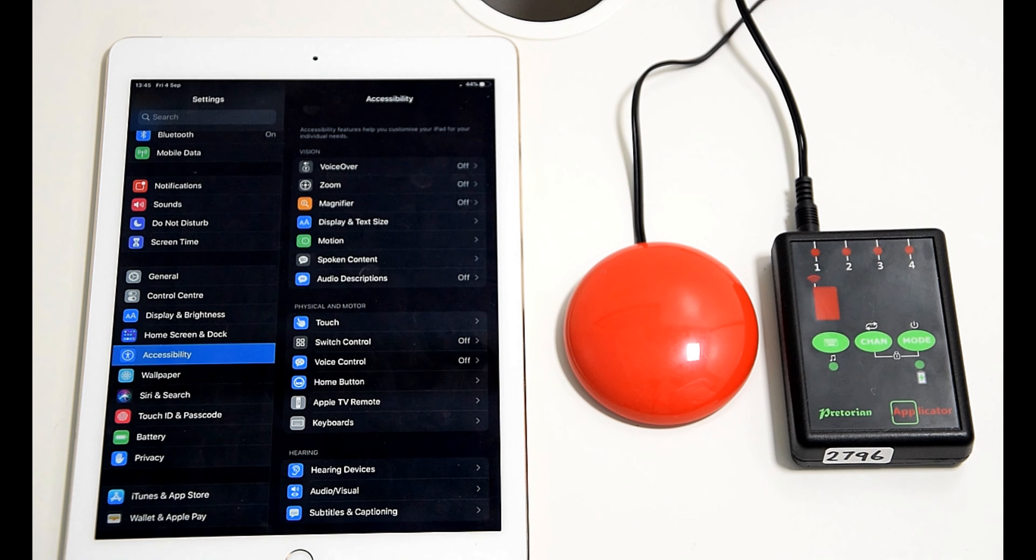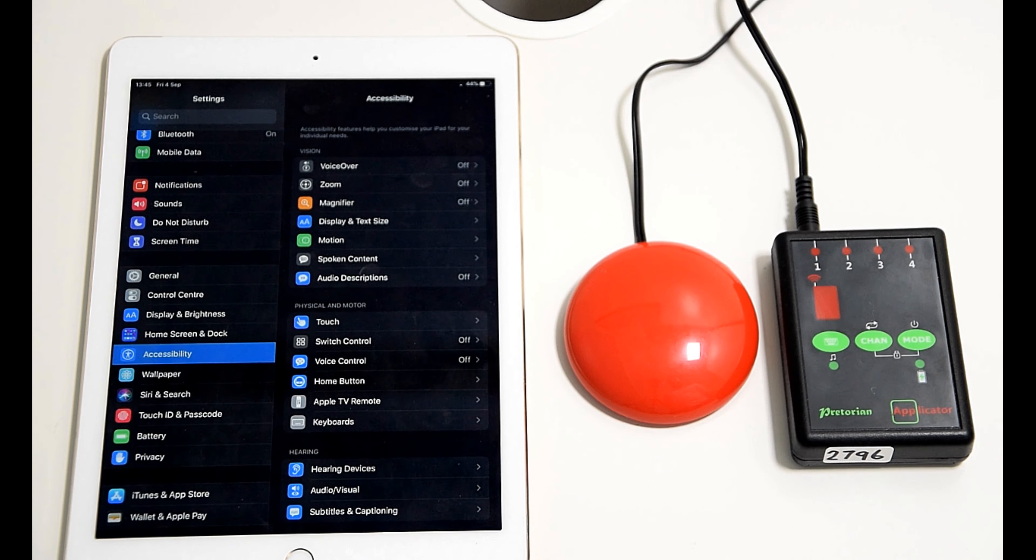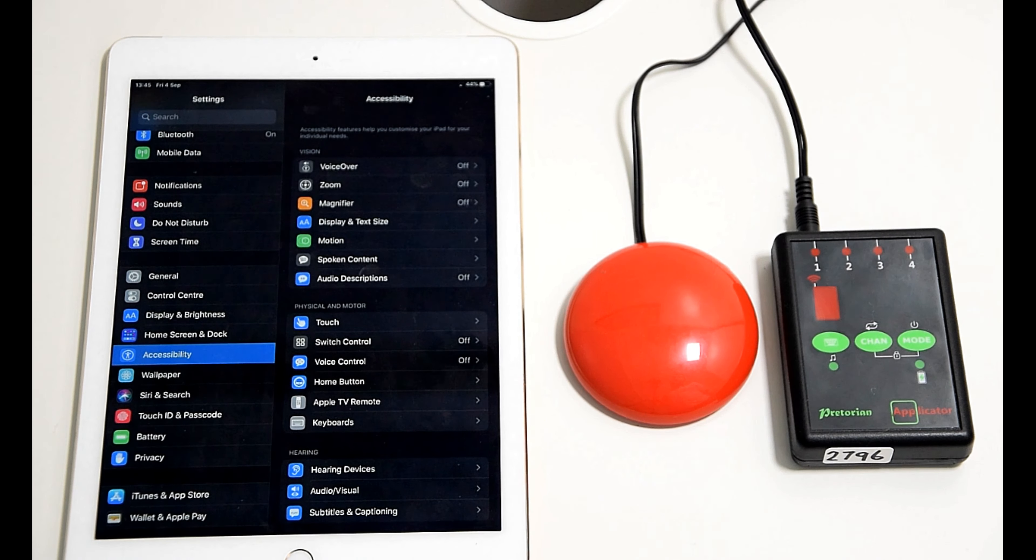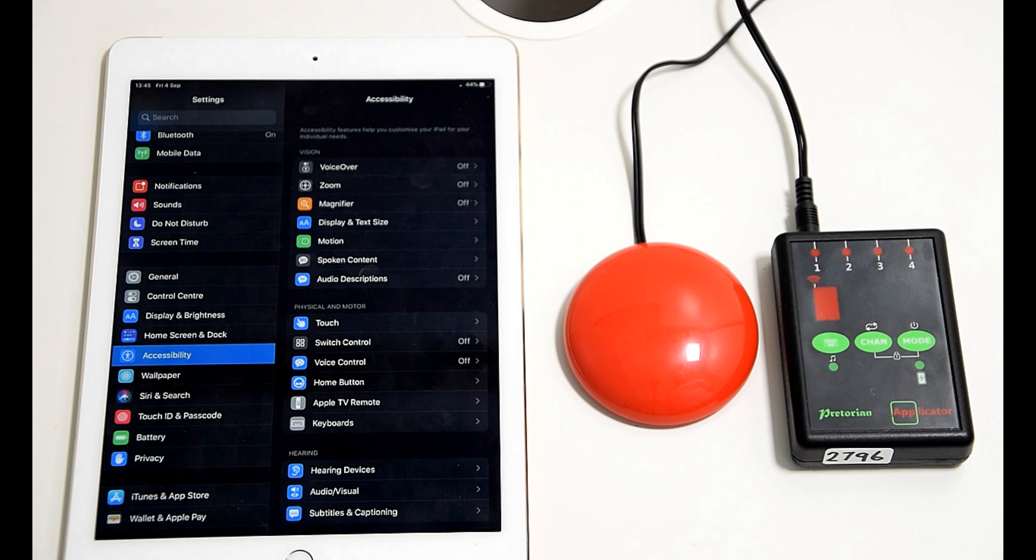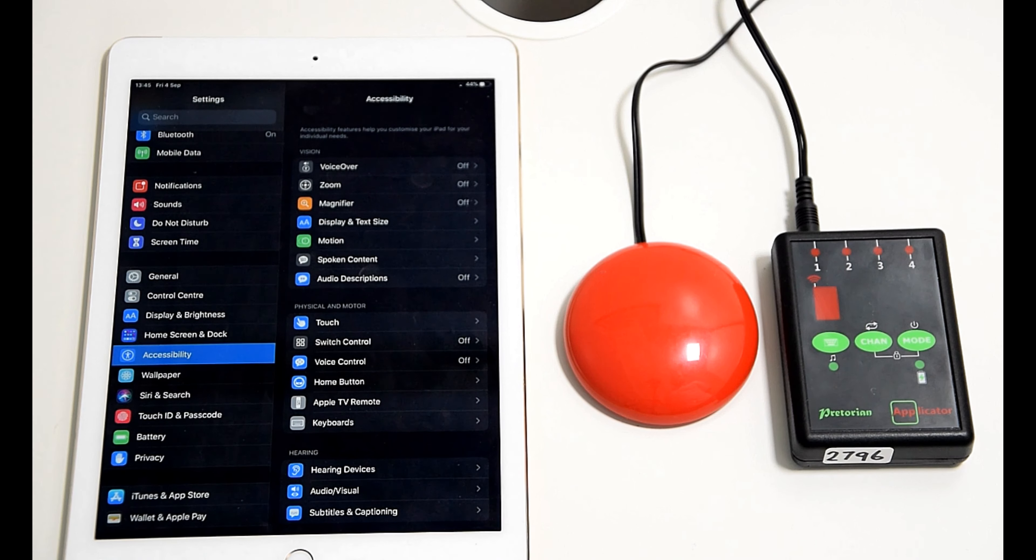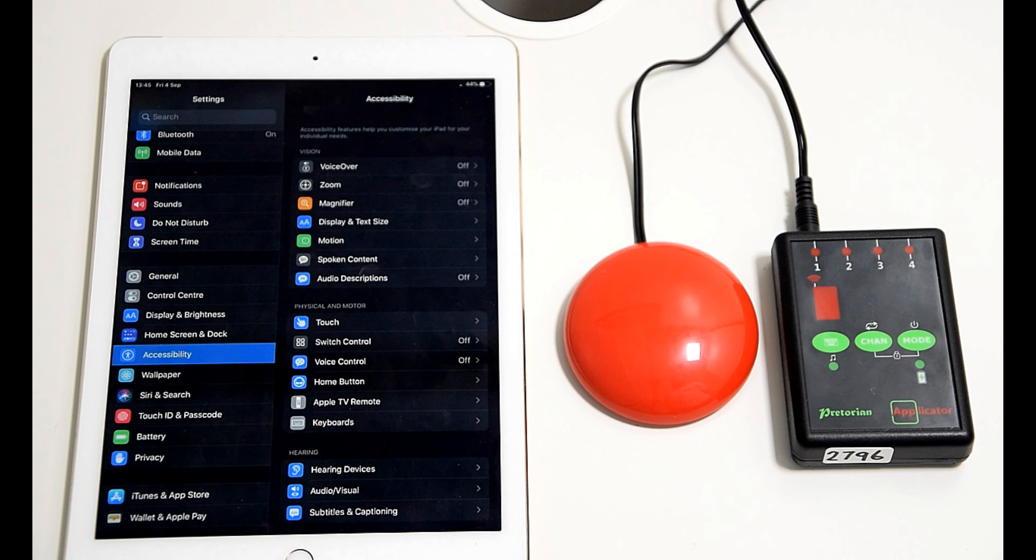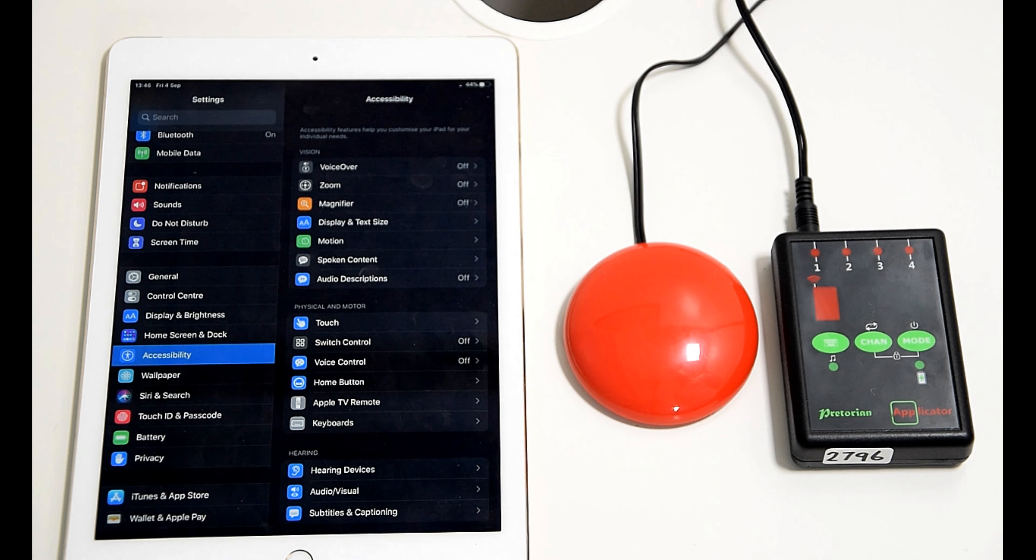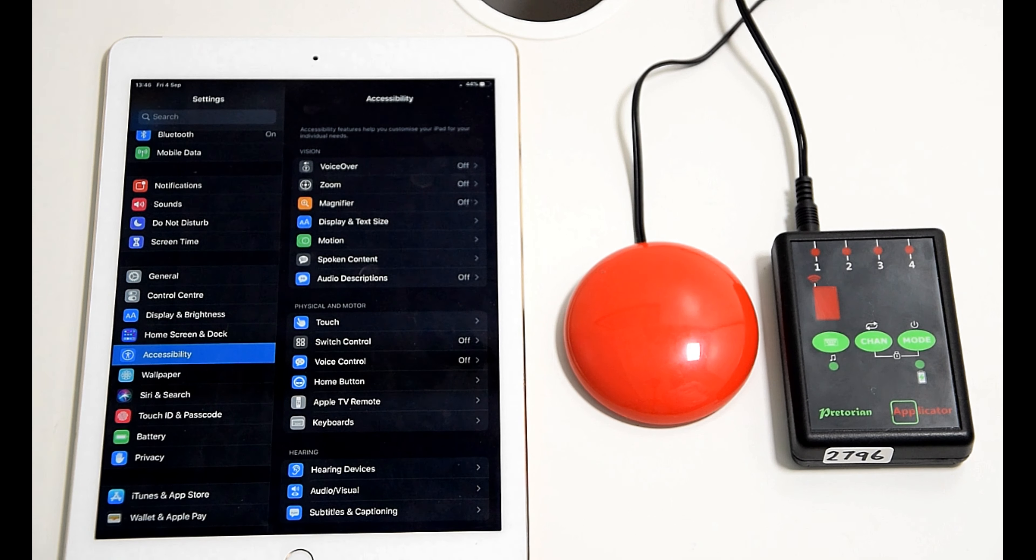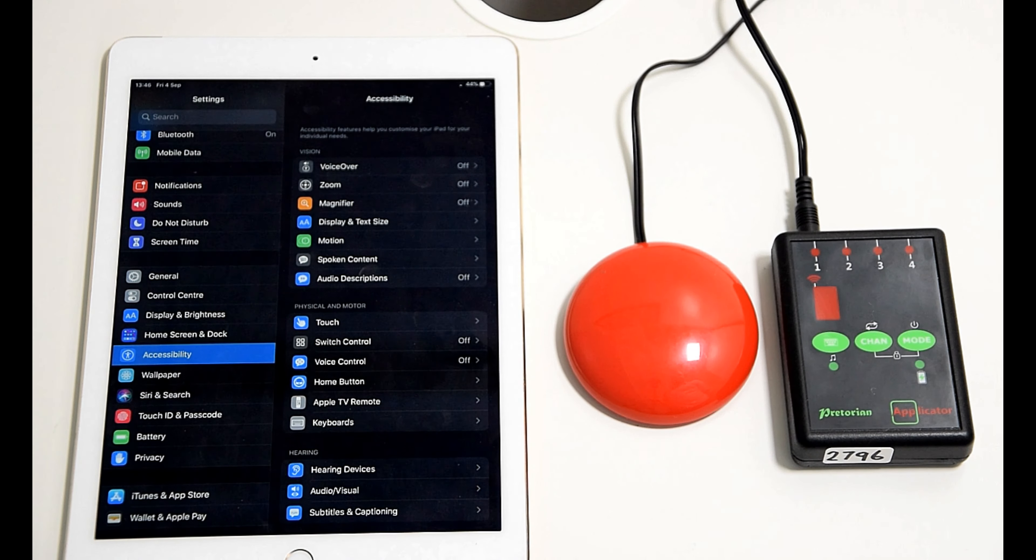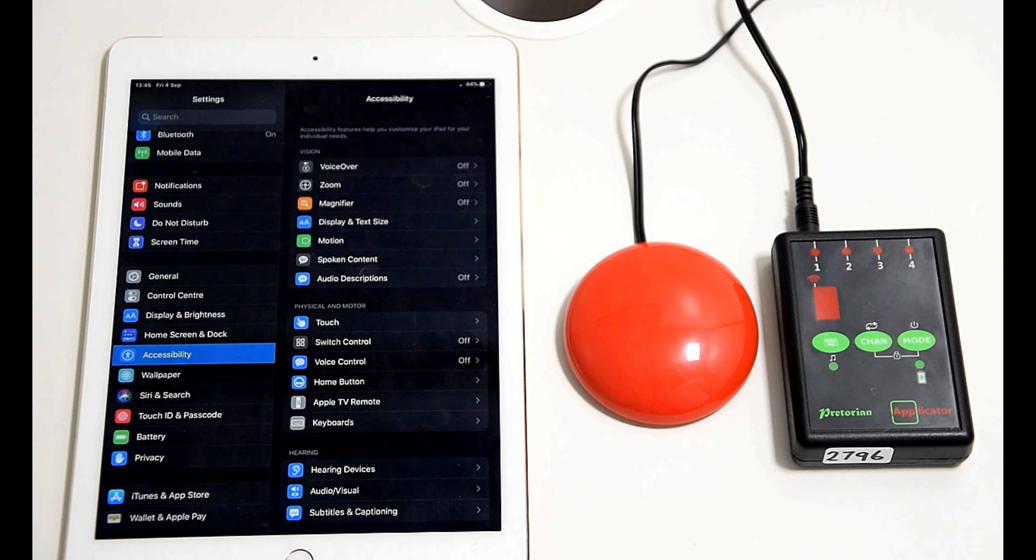The single switch scanning is basically dwell clicking, so you scan, you choose what you want to click within the boxes, and then you stop pressing the switch and let it pick the thing for you. It dwell clicks like you might have seen in other videos where we dwell click by hovering over something with a mouse alternative for a couple of seconds or however long you set it for and it clicks it for you.